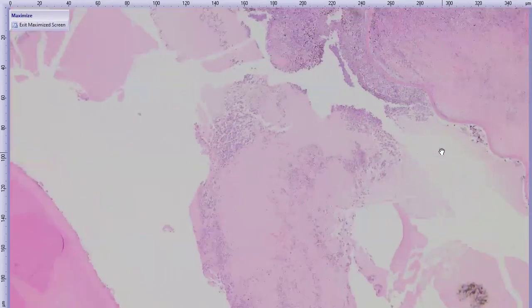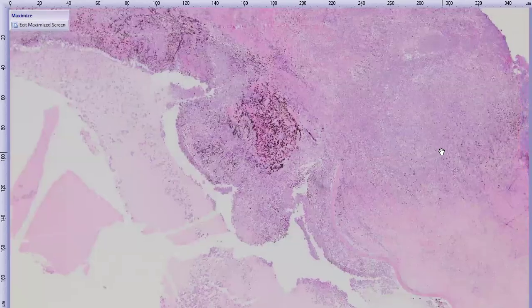I think more often we blame, if we see a spontaneous lens capsule rupture in the context of really severe inflammation, it's more often fungal cases where we have fungal hyphae that are invading the capsule. And those guys may be destabilizing the capsule, but I do think that there may be some cases where inflammation alone may be involved. But anyway, that's kind of speculative. And just some neat findings.